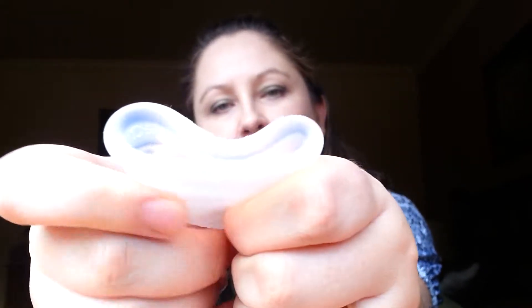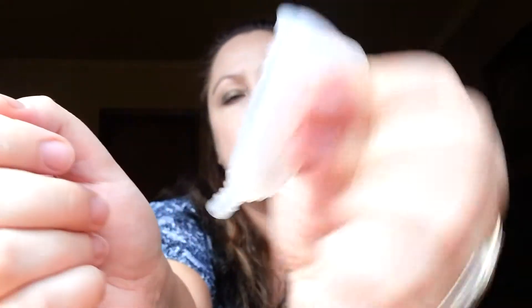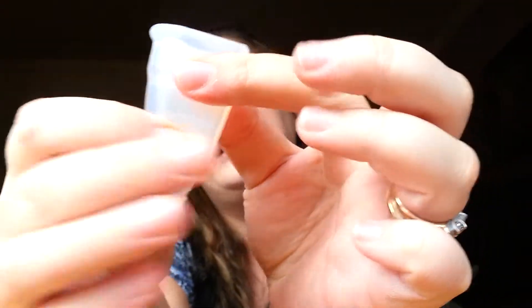The way you use it is you fold it like this — squeeze it all together. There are two methods you can use to fold it, but this is the one I did: squeeze it together, then fold it in half, and there we go. You go ahead and insert that, and once inserted you need to rotate it about 360 degrees clockwise to make sure it opens and is in the right position.